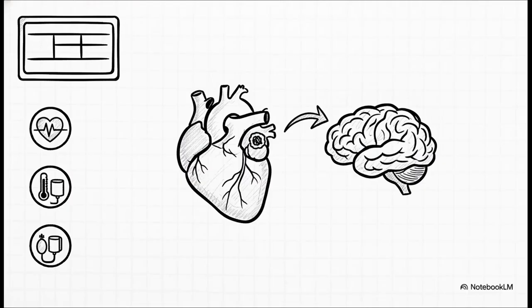Keep them on the monitor. Did they slip back into that bad rhythm? Are their vitals staying stable? And this is huge, especially for patients with AFib or A-flutter. You are now on high alert for signs of a stroke. Why? Because when you shocked that heart back into a normal rhythm, that organized contraction could have dislodged a tiny clot that was hiding in the atrium.